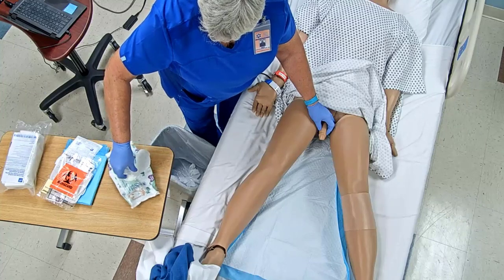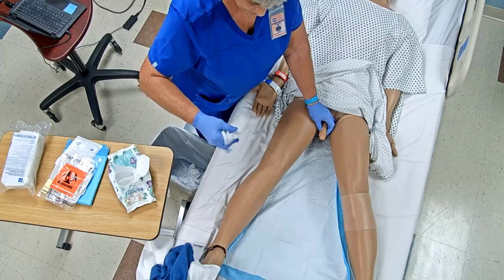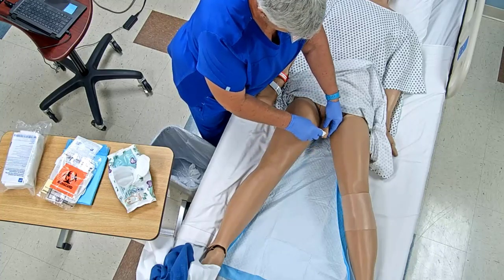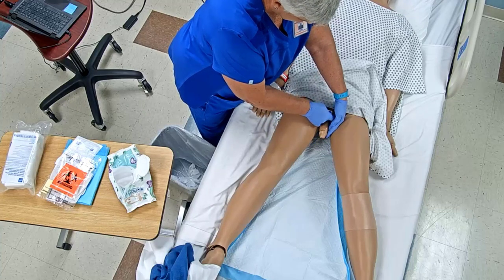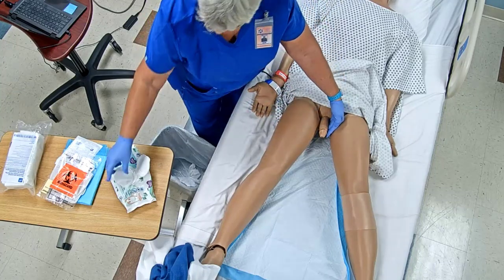I'm going to have to get you some new ones here in just a little bit. So I'm going to kind of fold this in half. On this side, we're going to do all four sides. We're going to work from the glans, from the distal to the proximal, back towards the body. I'm going to change that, work back, throw that away.